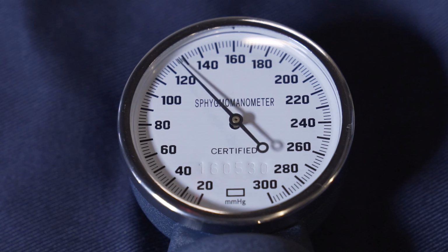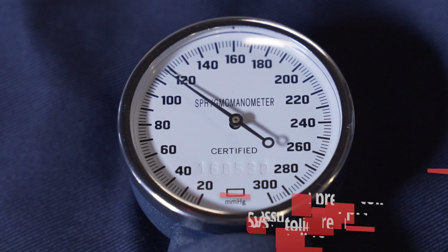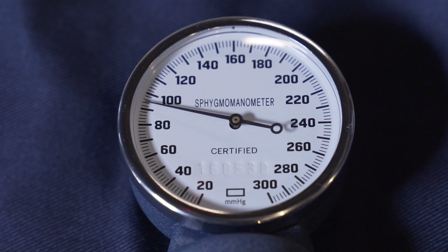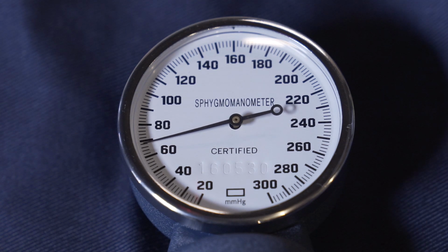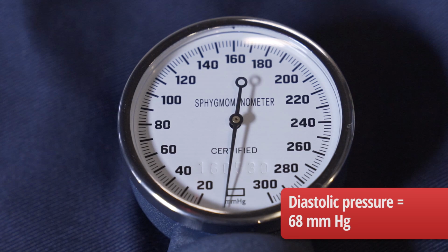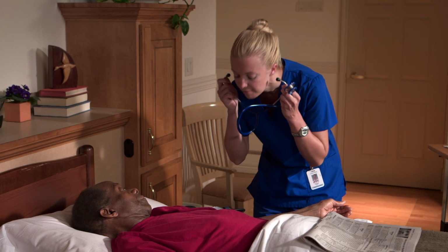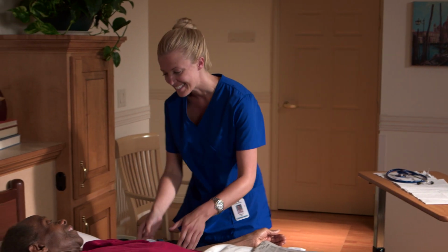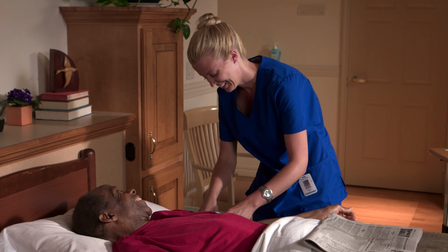The reading when you first hear the sound is the systolic pressure. Remember this number and continue letting the air out slowly. The reading when the pulse sound stops is the diastolic pressure. Remember this number and quickly let out the rest of the air. Excellent, Mr. Green. It's right where it normally is. Oh, good.